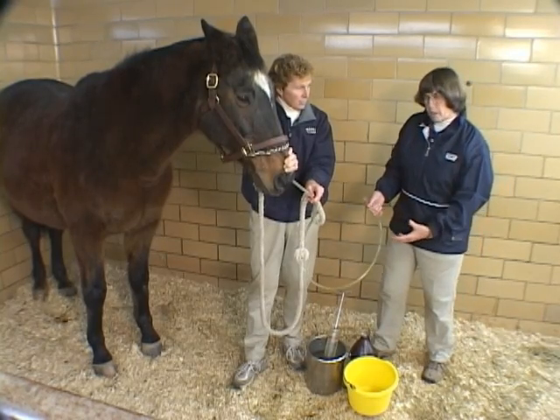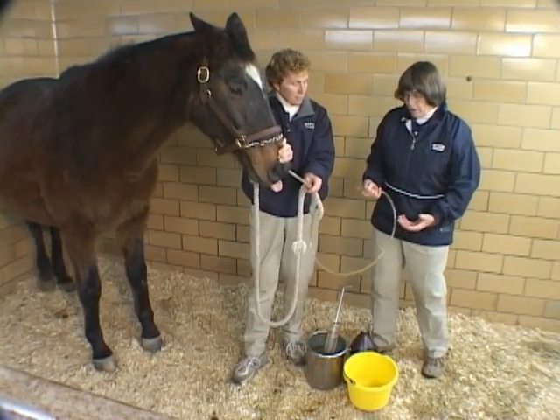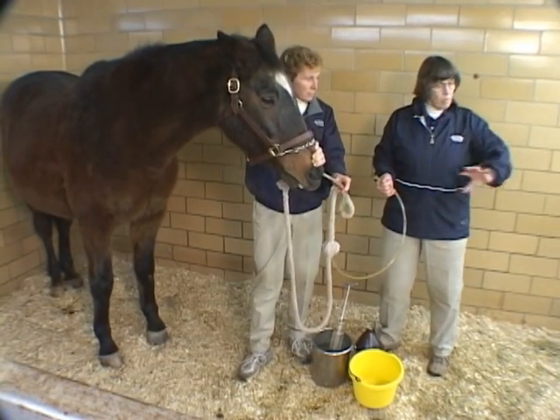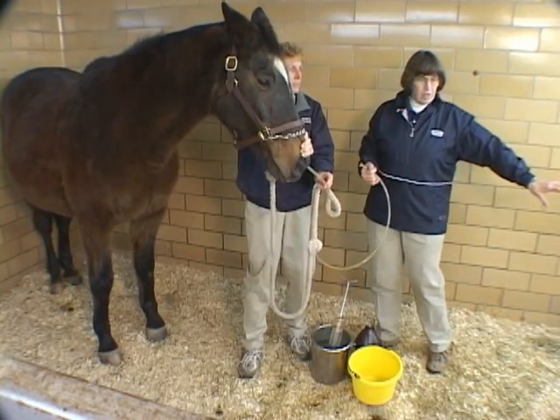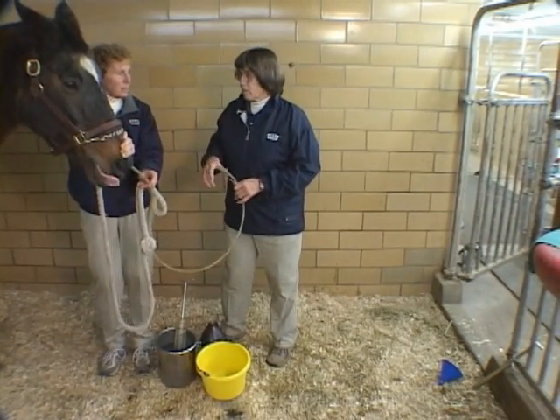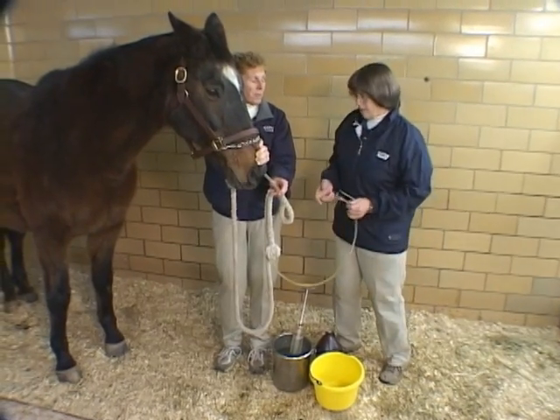One of our safety features to think about with this equipment is that we want the horse and the people positioned such that if we have to exit in a hurry, we can be out the door. You don't want to get yourself in a position where the horse is between you and the door.